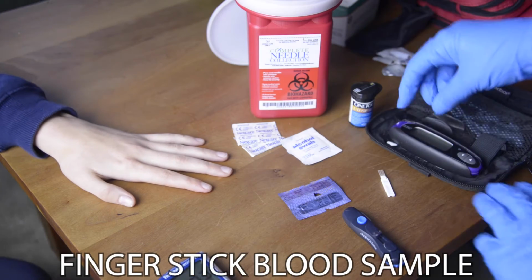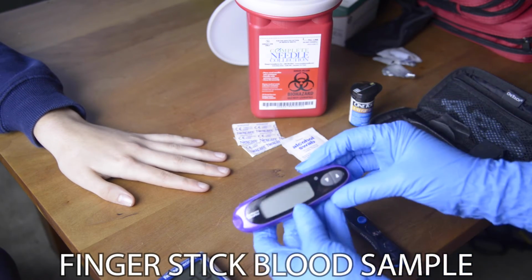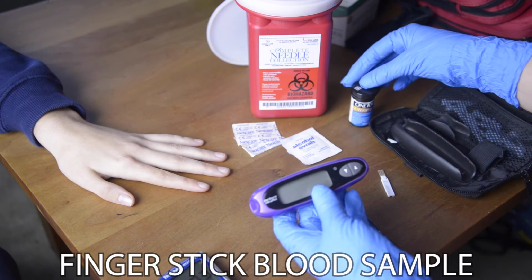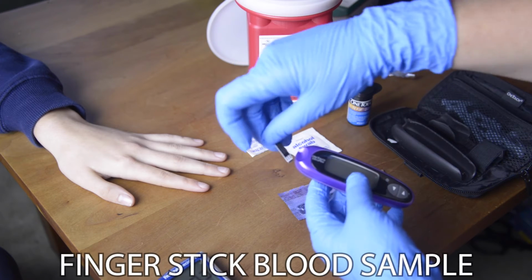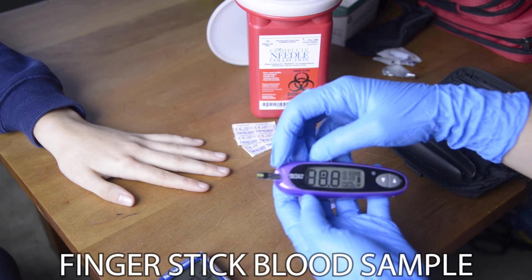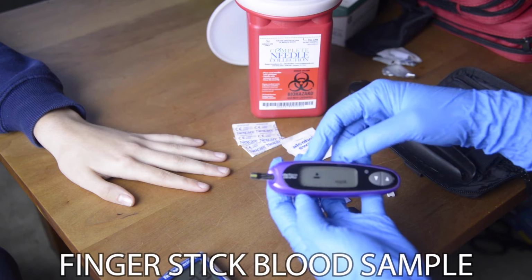Now, in a lot of situations, patients may have their own meters, which do not require calibration, especially if they are diabetic. A home meter is appropriate for you to use as an EMT. This is not one that requires calibration, but you do need to verify that it is the right kind of test strip for the right kind of meter.